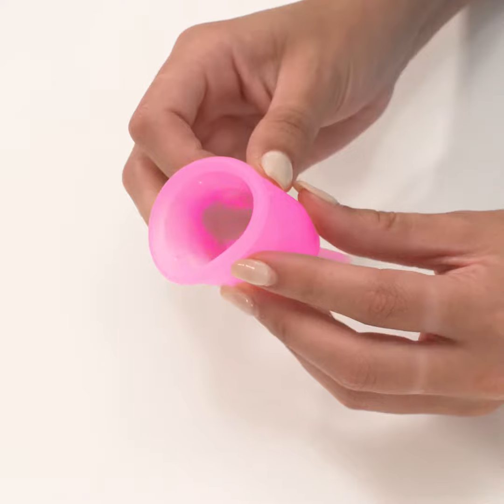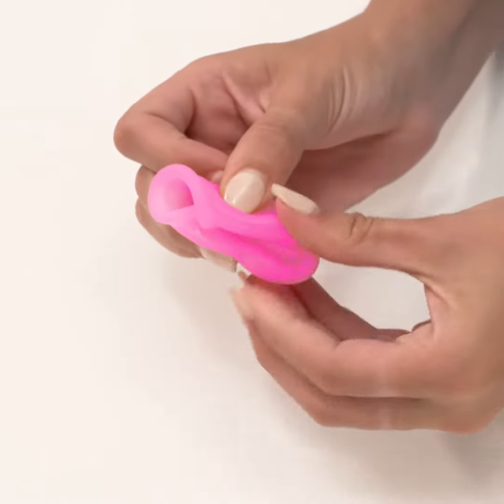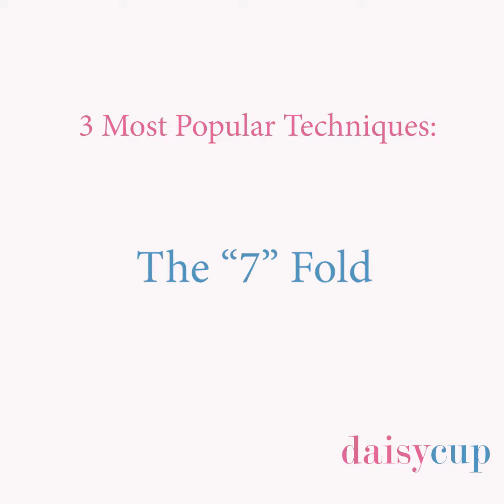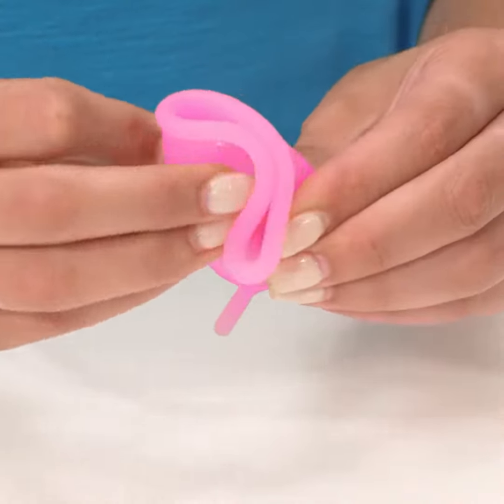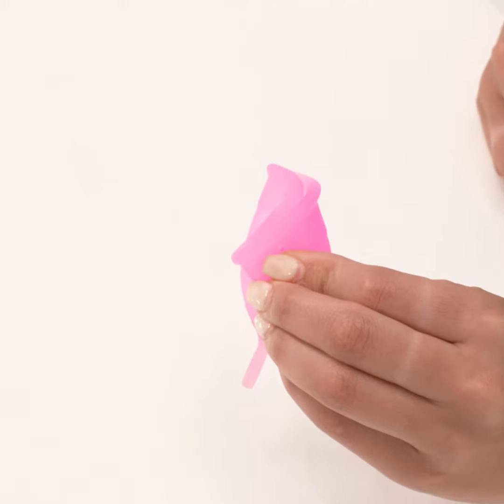The punchdown fold: push one side of the cup down to the bottom of the cup, then pinch the sides together. The 7-fold: pinch the sides of the cup together, fold one corner down toward the center so that the cup forms a 7-shape.